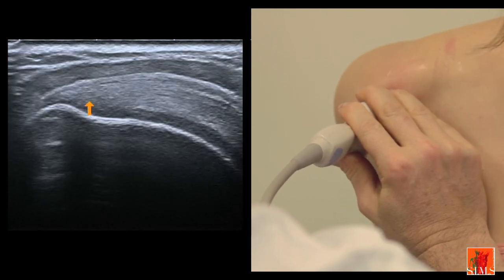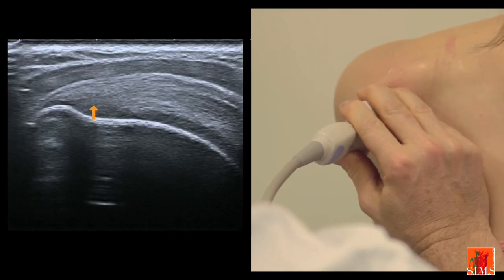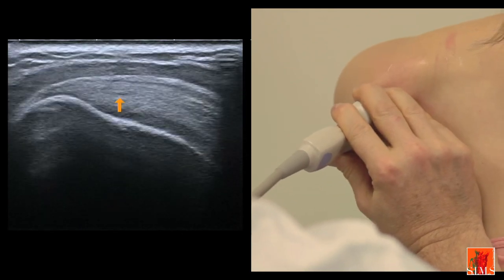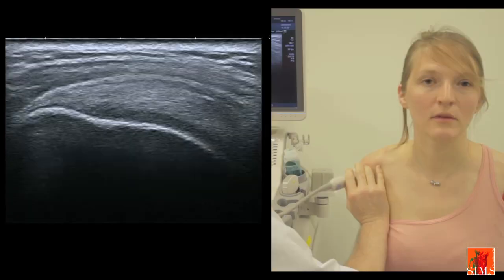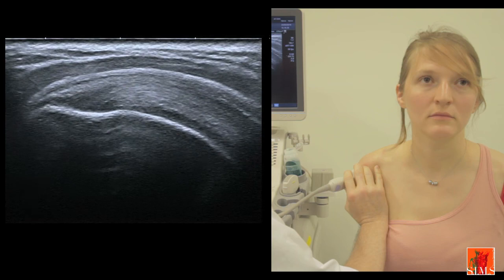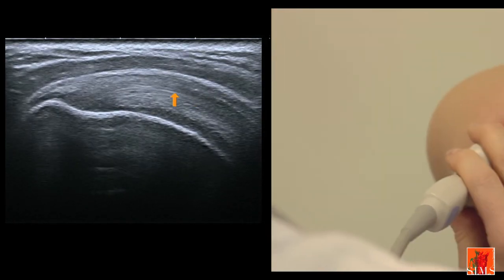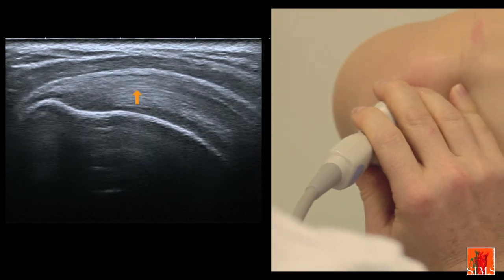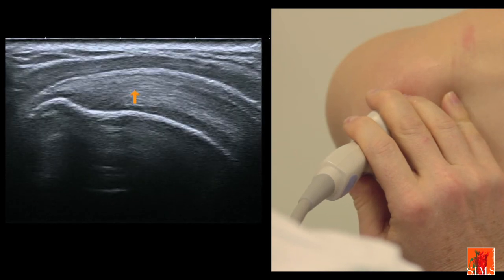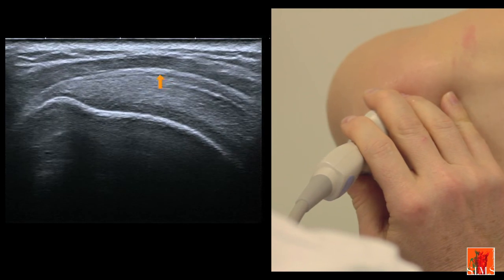A little further inwards, an area of anisotropy which corresponds to a change in the direction of the fibers. That anisotropy can be countered by directing the transducer differently. Still on the same image, in favourable cases we may be lucky enough to visualize the anterior cylindrical bundle, which we can see here in the form of perfectly parallel fibers that look like a tendon within the tendon. Superficial to the supraspinatus muscle tendon, we notice this non-fibrillar area, which corresponds to the subacromial subdeltoid bursa.